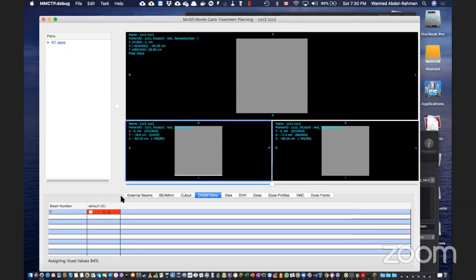We're almost there. Dr. Omid, why are the calculations taking so long? This is a big phantom, okay? It's huge. I've defined a phantom of 400 voxels by 400 by 80, and now it's assigning the medium to each of these voxels and writing it, because it has to create that file. The file size is roughly 600 megs. Even if you have a cluster, it doesn't split the job. This is the creation of the phantom. It's not the Monte Carlo simulation.